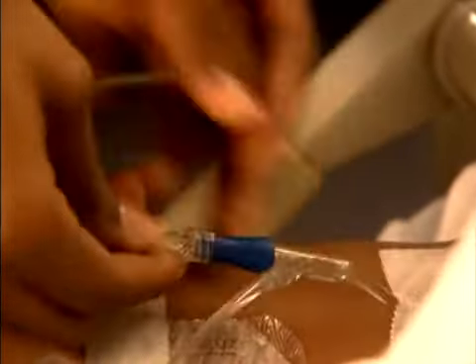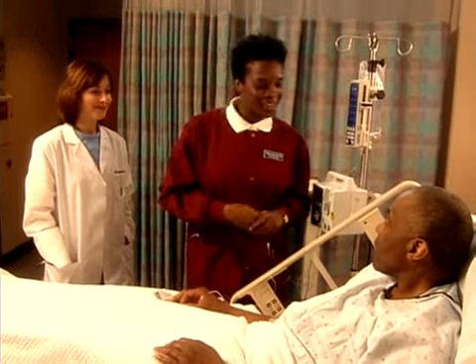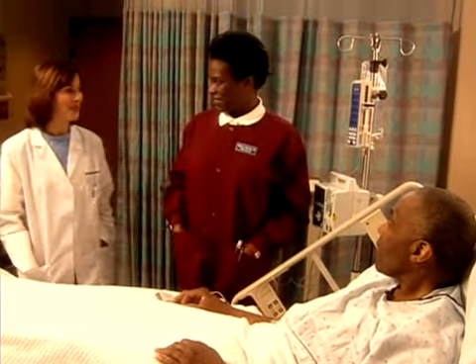You should assess Mr. Nixon and the pump about 5 to 10 minutes after the infusion starts to make sure everything's working properly. Okay, cool. We'll have a nice chat. All right, I'll leave you to it. Looks like things are under control. Thank you. How are you, Mr. Nixon? Great.